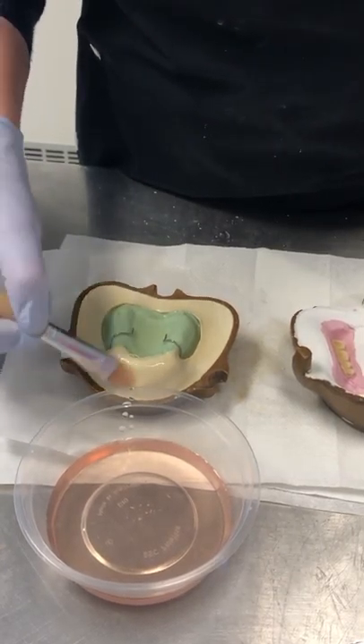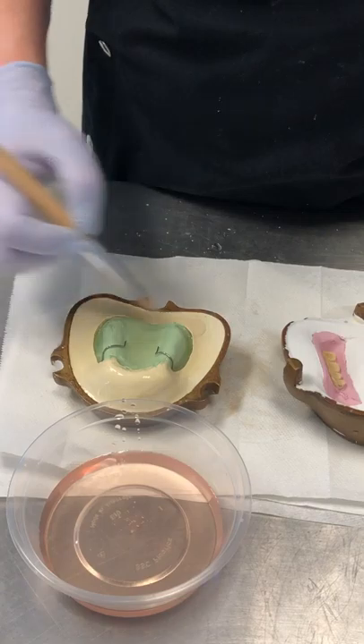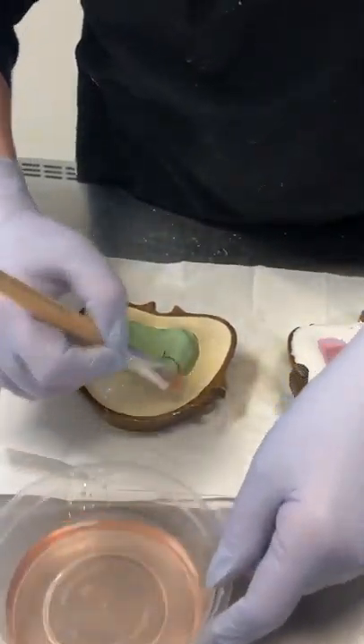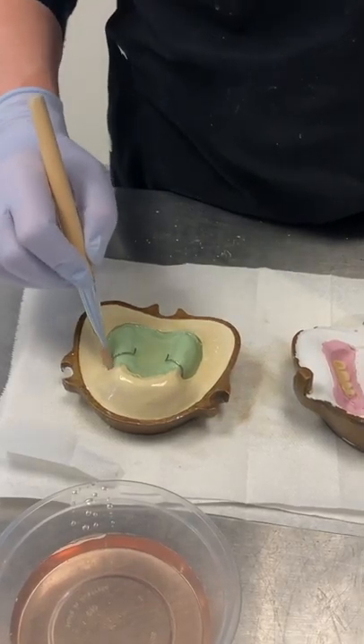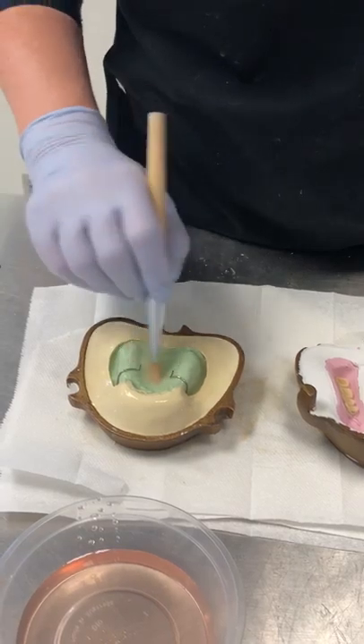If you don't do this stage, then your stone will stick to the denture base, and it's extremely difficult to remove it. In fact, it's almost impossible. So this is a really vital step that you cannot afford to miss, and don't forget to do this. You must do it.